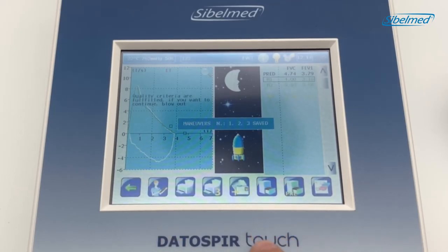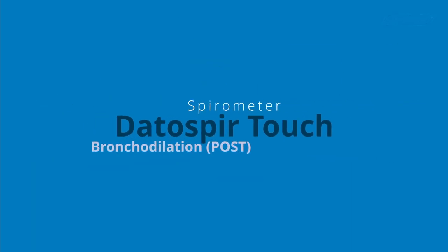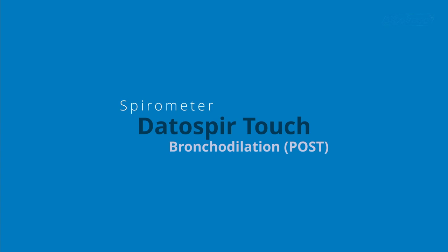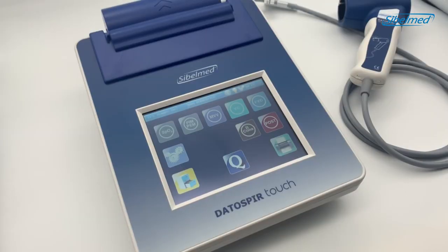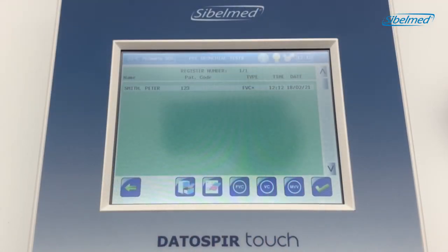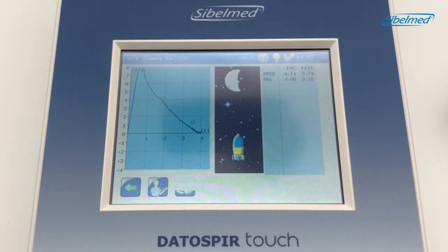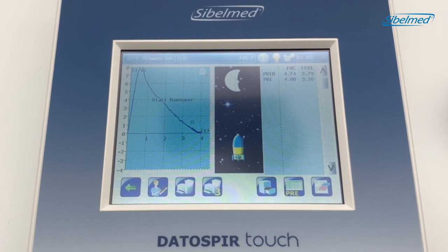We are going to save the test in the database and also use the pre-icon to save for a dilation test. Click on the post icon to start the dilation test, then search and select the FVC test, accepting with the green icon. The patient should be ready after the medication. Now we will choose the basal test from the three best saved — we can modify this selection later. The curve will be presented on the display and we are going to prepare the transducer.